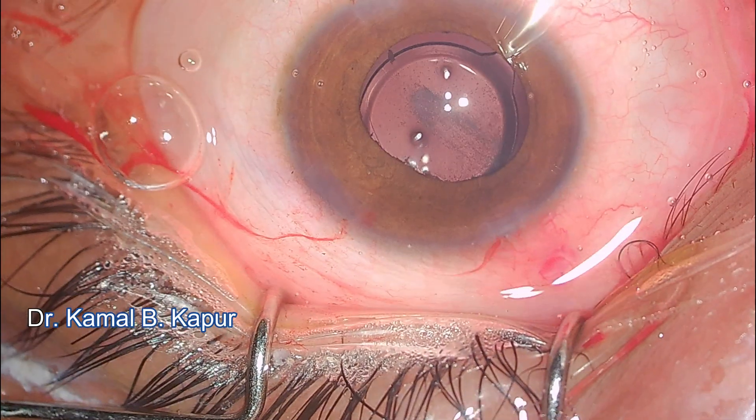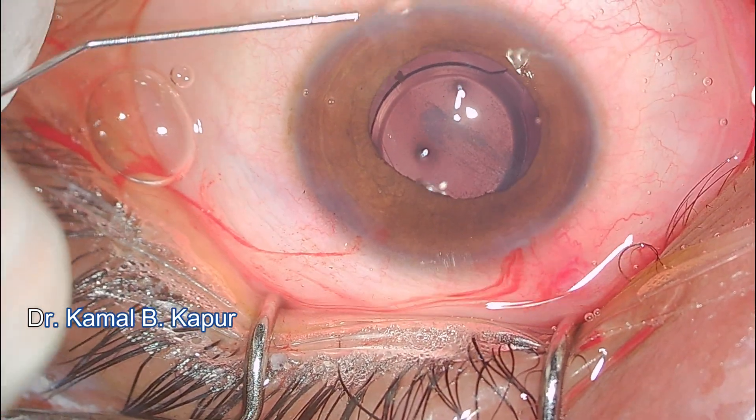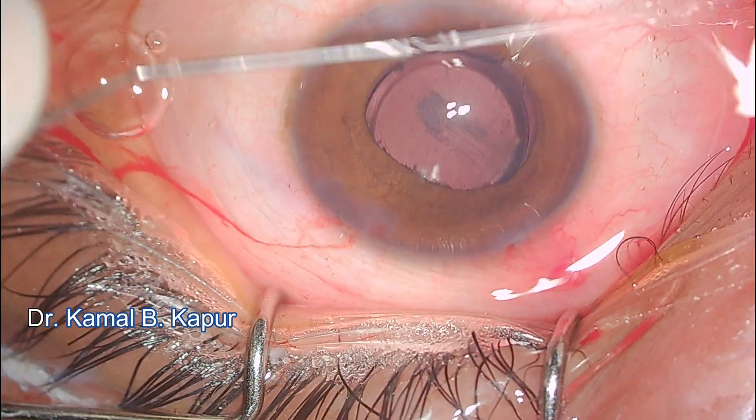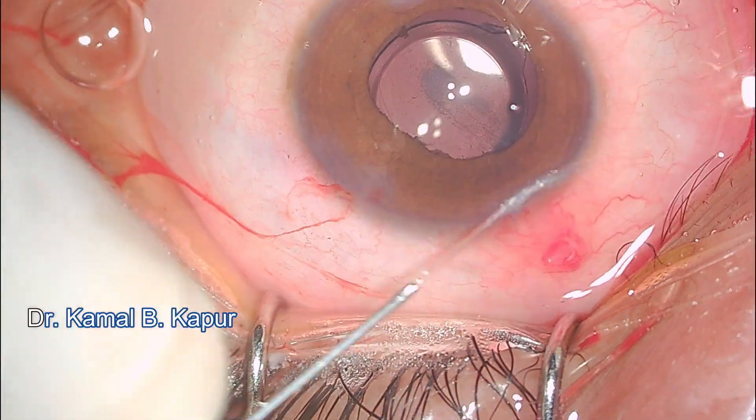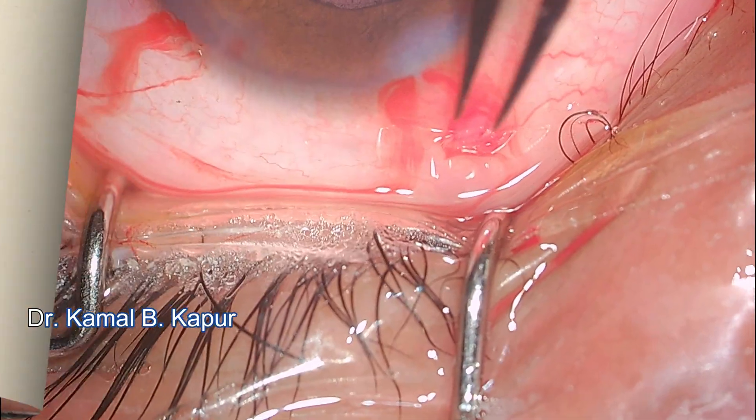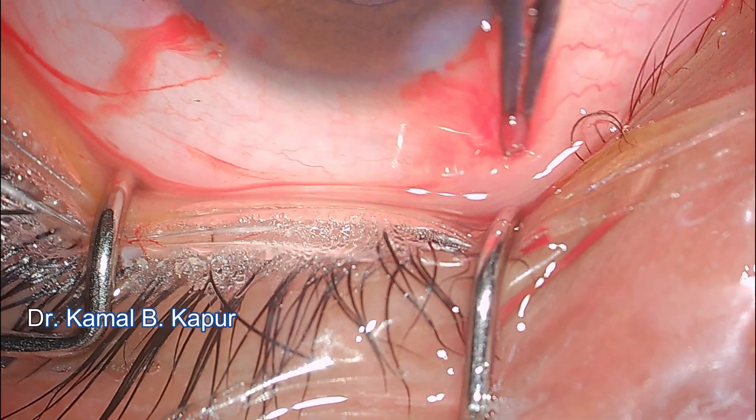We proceed with bimanual viscoelastic removal. The wound is hydrated very well and the eye is doing well. There is a small plaque on the posterior capsule which I decided to address at a later point.